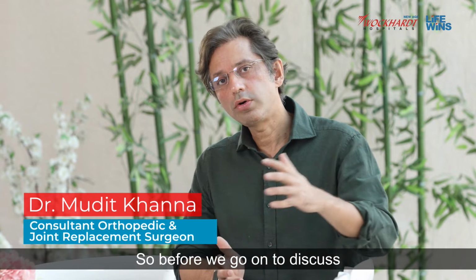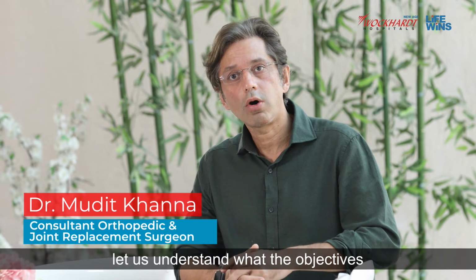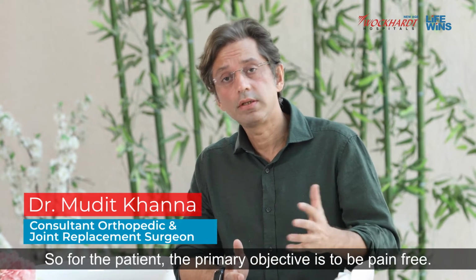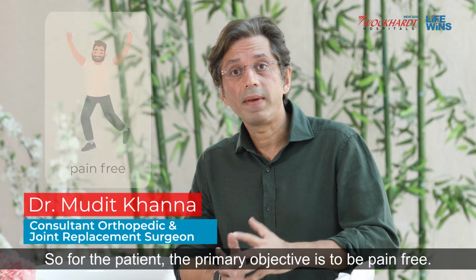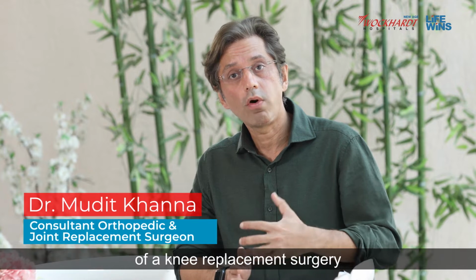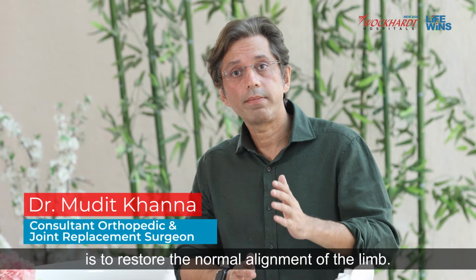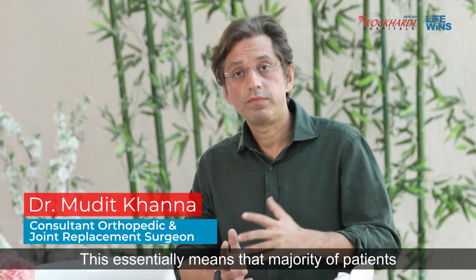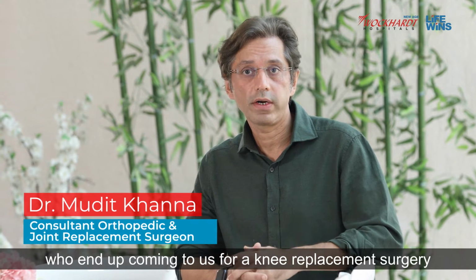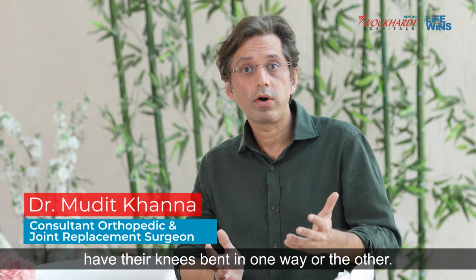Before we go on to discuss what a computer assisted surgery is, let us understand what the objectives of a knee replacement surgery really are. For the patient, the primary objective is to be pain-free. But from a surgeon's perspective, the primary objective is to restore the normal alignment of the limb. This essentially means that the majority of patients who come to us for a knee replacement surgery have their knees bent in one way or the other.